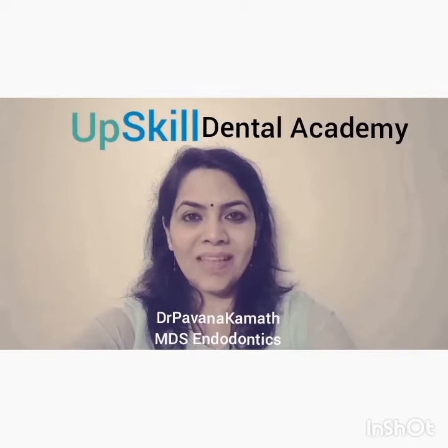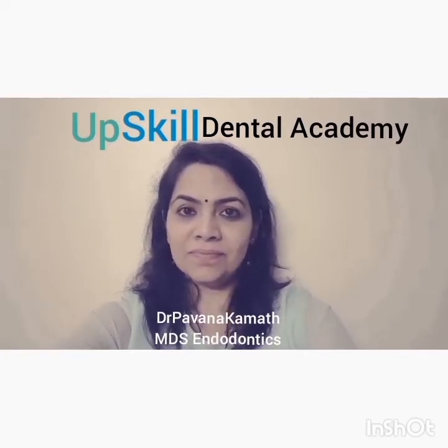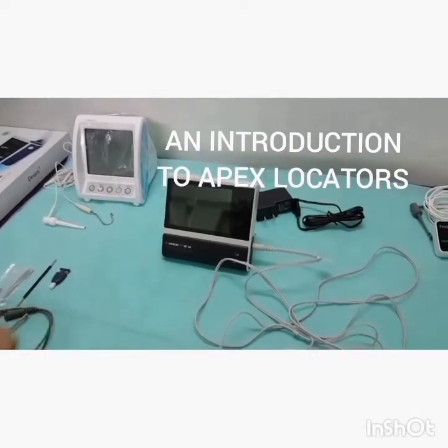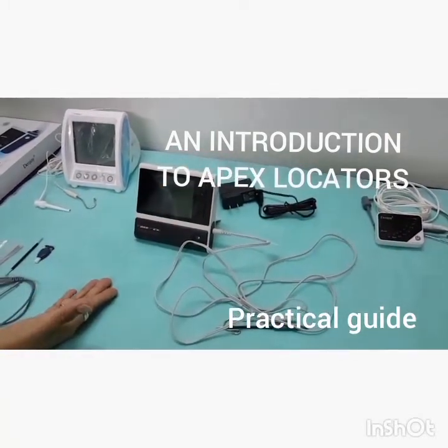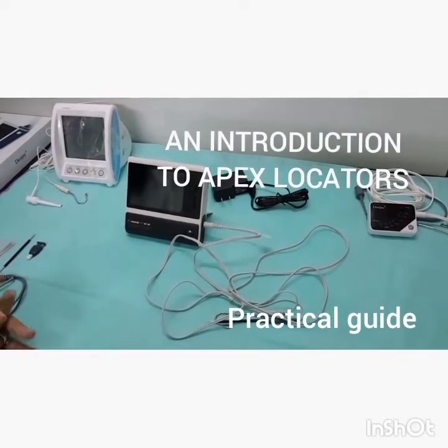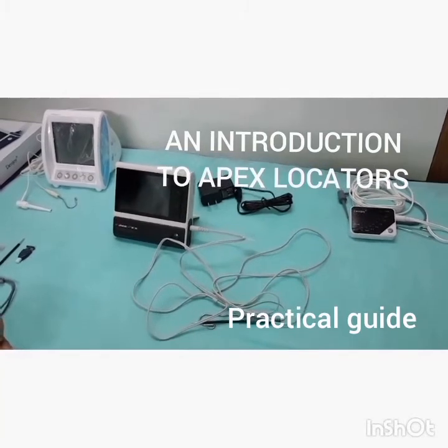Hello everyone, today's video is on apex locators, which is a must-have in the endodontic armamentarium. Apex locators can be of different kinds — they can be compact or tabletop. The benefit of having a compact apex locator is that it is easy to carry and ideal for a first-time investor cost-wise.